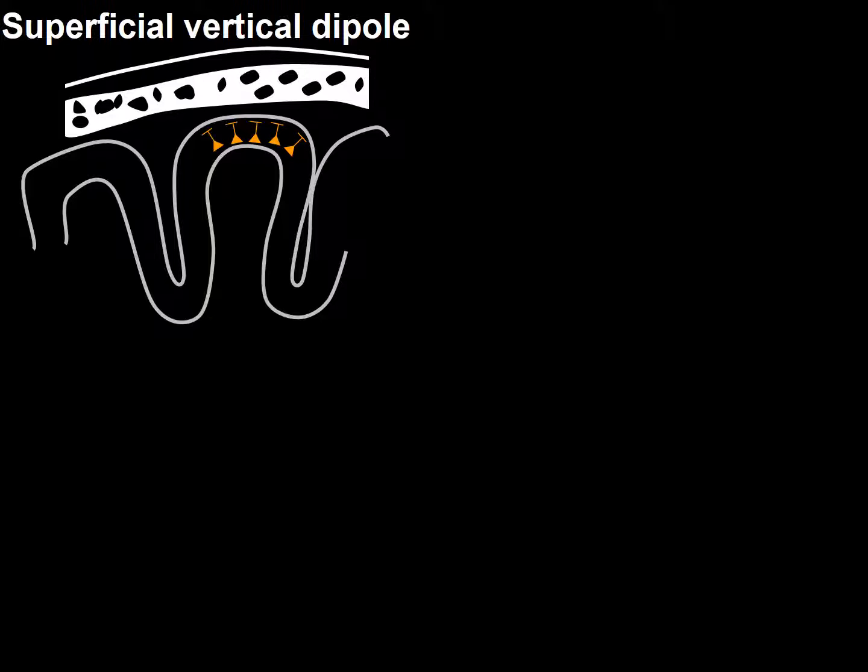The representation of the layer of pyramidal cells generating the EEG waves can be made according to the orientation of the dipole created by their activation, as you can see in this frame. The arrangement shown in this frame is the simplest geometrical arrangement of a dipole layer.